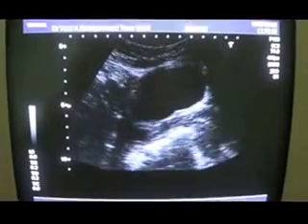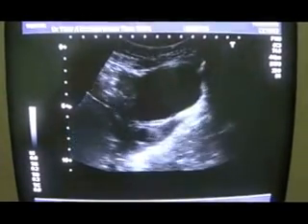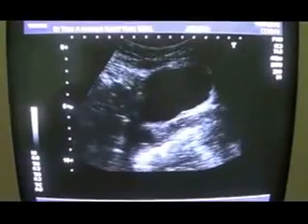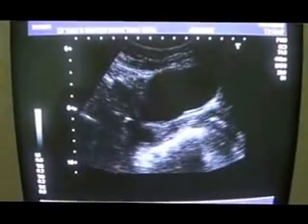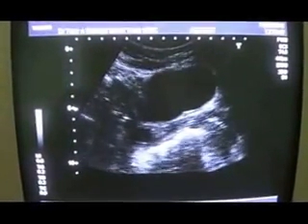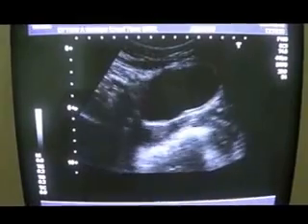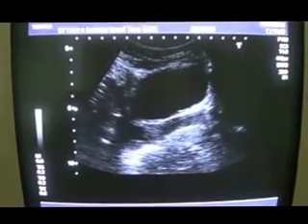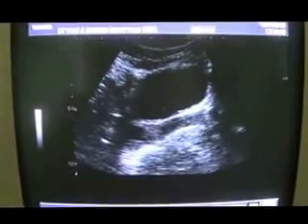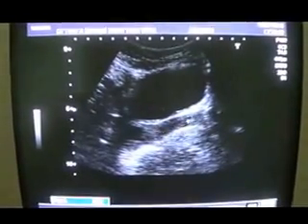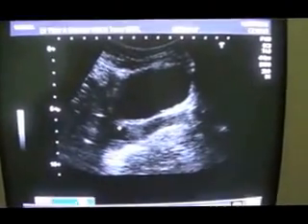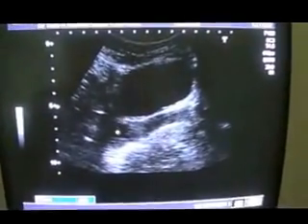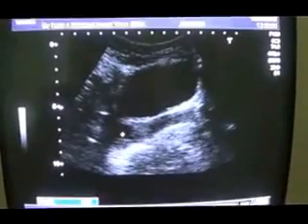This is an ultrasound of a 28-year-old female who had a hysterectomy performed a year back. What I am trying to show you is the vaginal stump. This is the vagina and this is the vaginal stump. The cystic area that we are seeing inside is the Nabothian cyst.